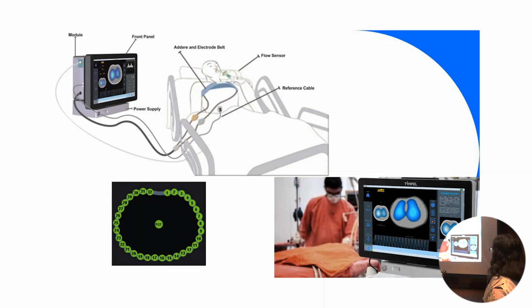This is sort of a better visual of, again, what it's going to look like at the bedside. You're also able to press a little button here, and it will show you if you're having any issues with electrodes having good contact. Really, everybody's body is a little bit different. And so they make these little foam wedges that kind of go at the top there that you can stick there and get better contact. And if for some reason you continue to still have a contact issue, you can usually disable about 2 to 3 of the electrodes and you'll still get good readings with that.